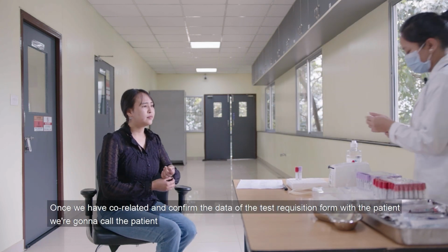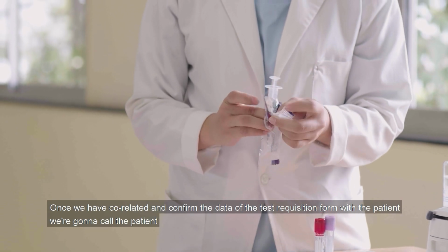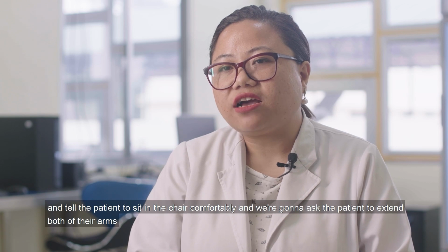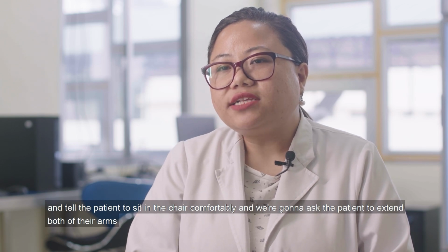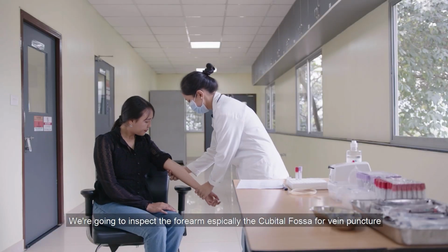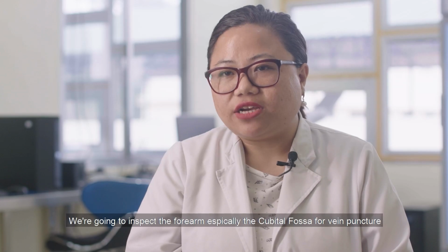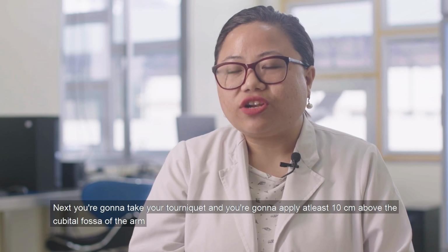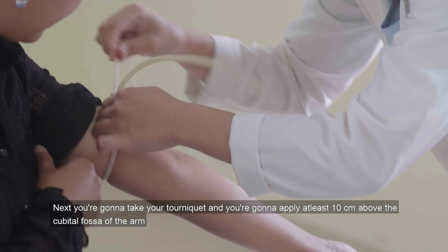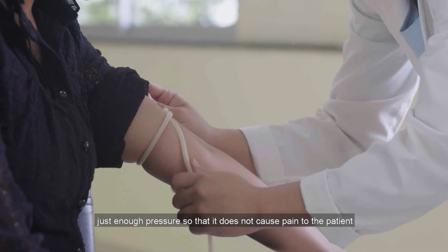Once we have correlated and confirmed the data of the test requisition form with the patient, we're going to call the patient and tell the patient to sit in the chair comfortably, and we're going to ask the patient to extend both of their arms. You're going to inspect the forearm, especially the cubital fossa, for venipuncture. Next, you're going to take your tourniquet and apply it at least 10 centimeters above the cubital fossa of the arm, with just enough pressure so that it doesn't cause pain to the patient.